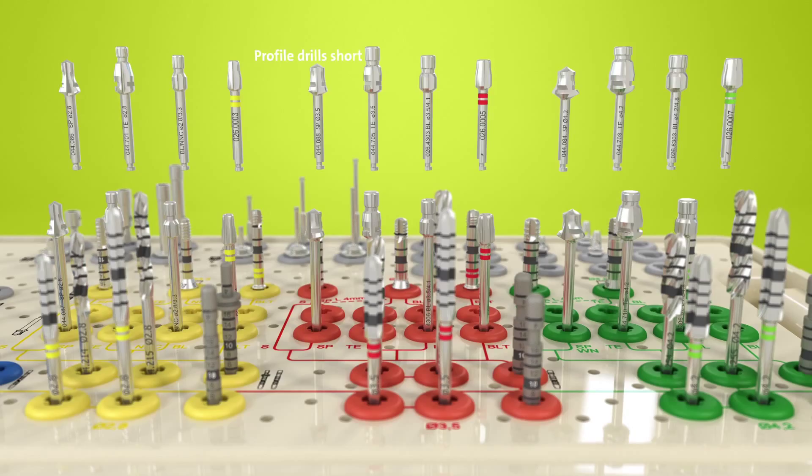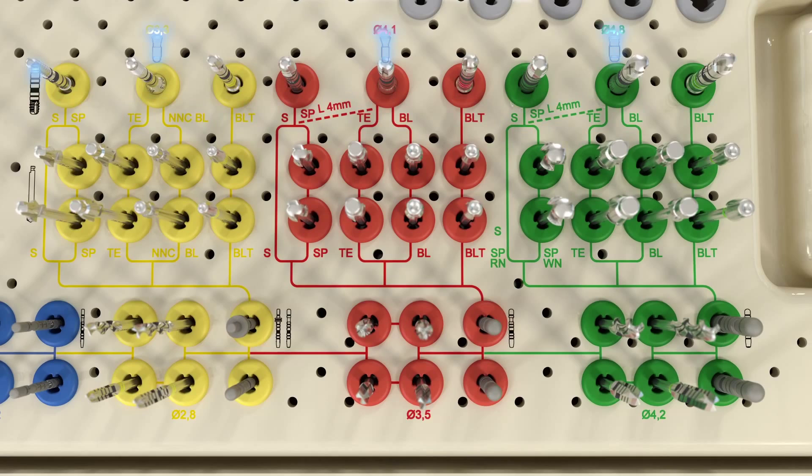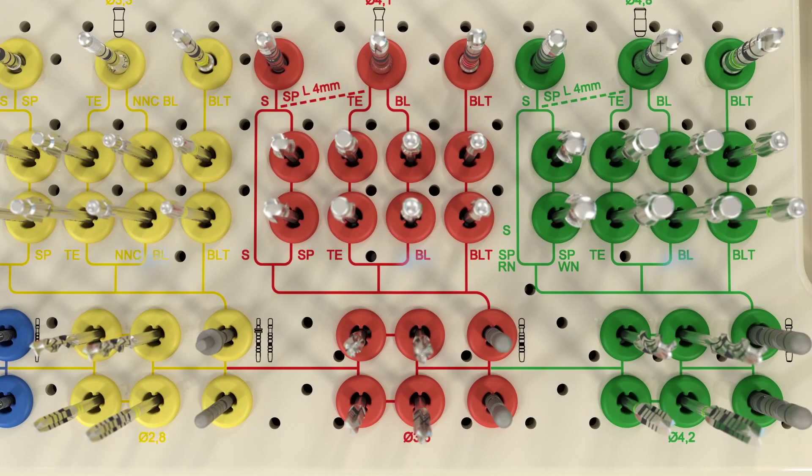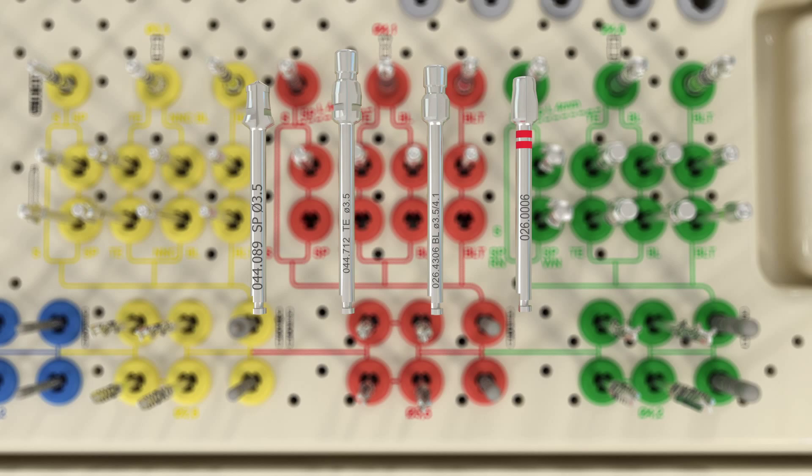Profile drills are available in a short and a long version. Following the colored lines will lead to the drill that should be used with a specific implant line, provided such an indication is relevant. For example, the S, the standard implant line, does not need a profile drill, but a BL, a bone level implant, requires one. Each drill is identified on its shaft.